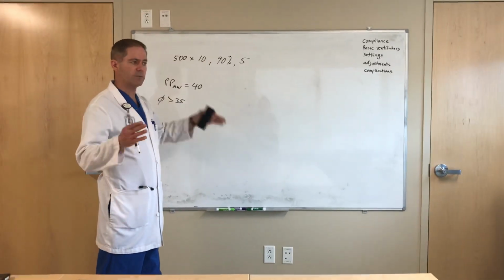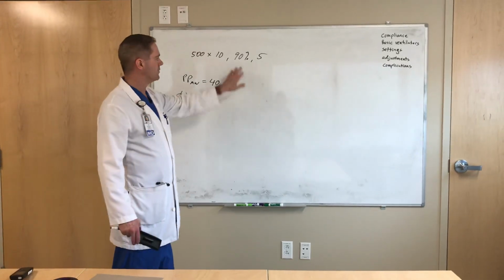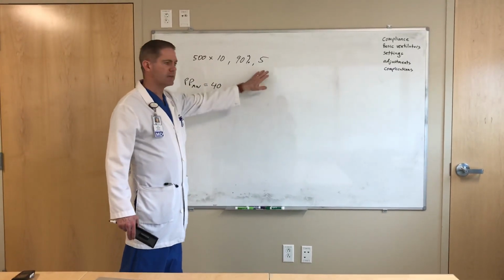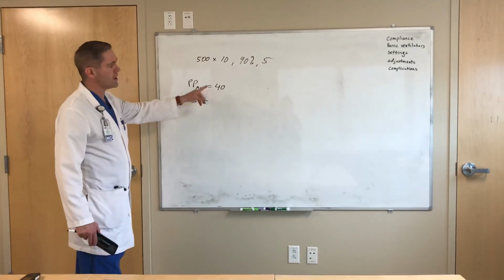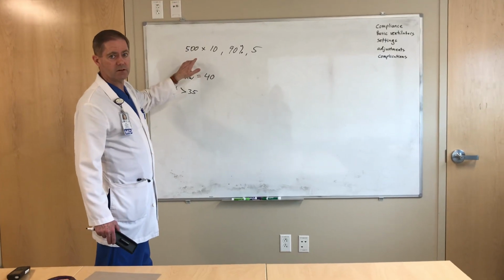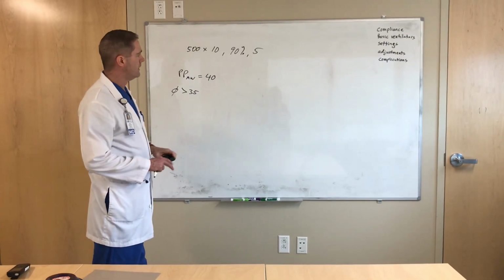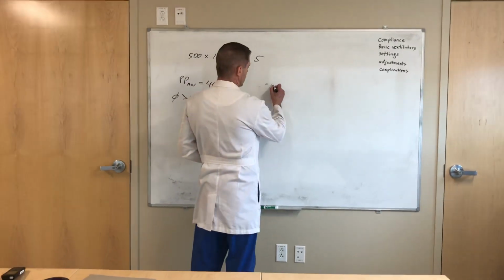Depending on the length of time you'll be managing the patient, if it's only short term, you're getting them from point A to point B, don't worry about it. Put them on 100%. Put them on a PEEP of 10. Just leave them there. Just do the best you can. But just look for complications of not ventilating the patient, all right? So the main complications you have to worry about are going to be things like a dislodged tube.